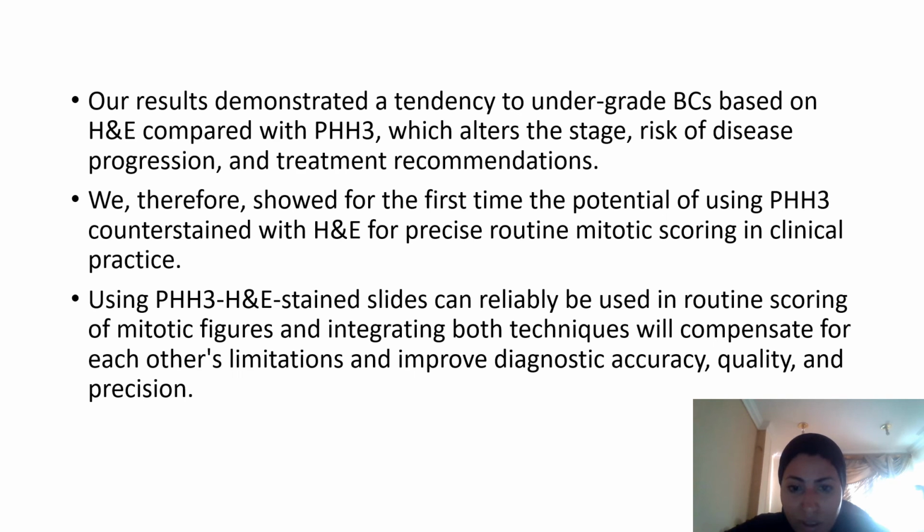Using a PHH3 stained slide can reliably be used in routine scoring of mitotic figures. And by integrating both techniques, both approaches can compensate for each other's limitations and finally improve the overall diagnostic accuracy, quality, and precision.